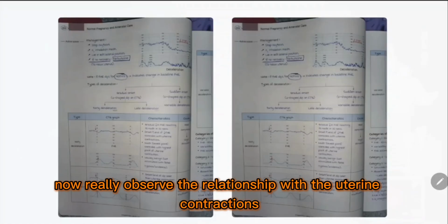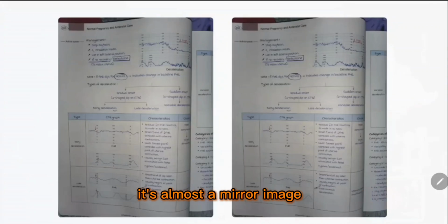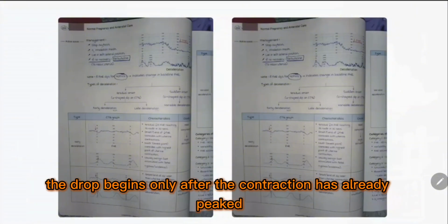Now really observe the relationship with the uterine contractions at the bottom of the graph. On the left, the early deceleration's lowest point, the nadir, perfectly matches the contraction's peak. It's almost a mirror image. But look on the right, the late deceleration is shifted dangerously. The drop begins only after the contraction has already peaked.